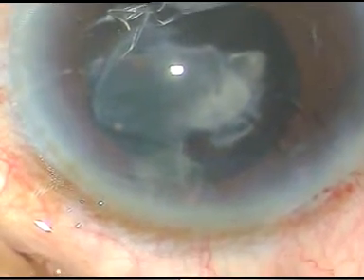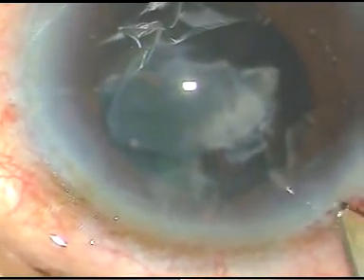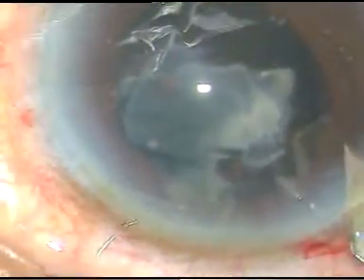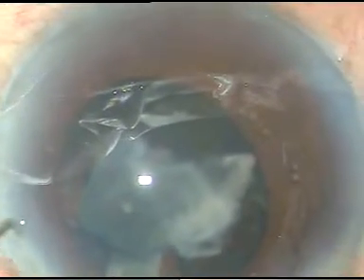Since it is soft epinucleus, I will be able to remove it by the cutter itself. I enlarge the main incision up to 3.5 mm so that I'm going to inject a multi-piece intraocular lens so that the cartridge easily goes into the anterior chamber.